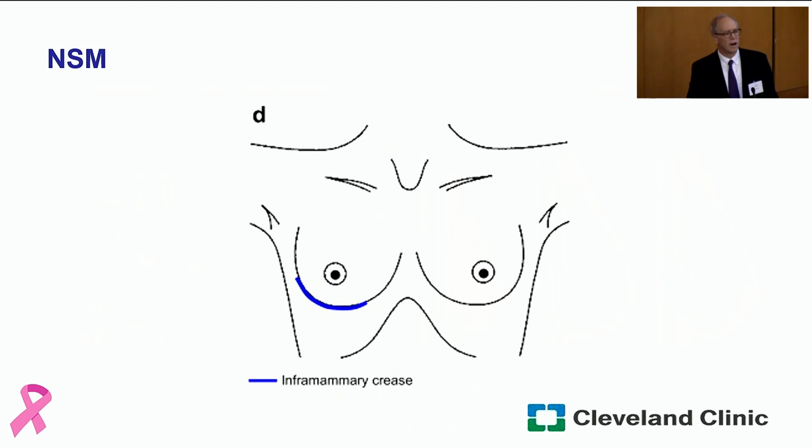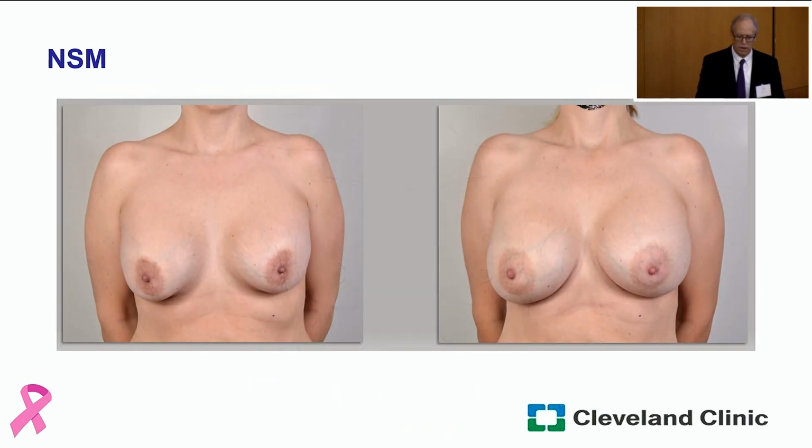Any incision that's on the breast distorts the breast. The incision itself contracts even without the radiation therapy. So it tends, when we make those lateral incisions, and you saw in the last one, it pulls the nipple laterally. And then the final thing is that it's also the best perfusion. So, this is sort of that lucky thing as well, so that we're able to do something that looks the best, that also gives us the best chance to be allowed to do this, because this is the best blood flow to the patient.